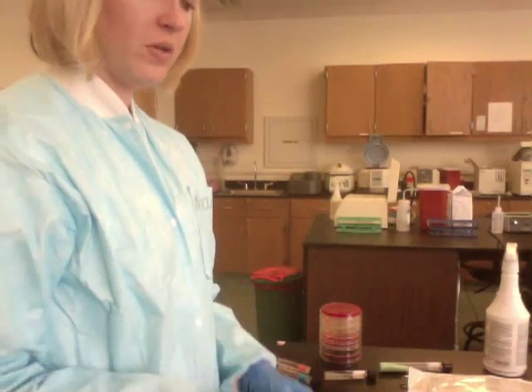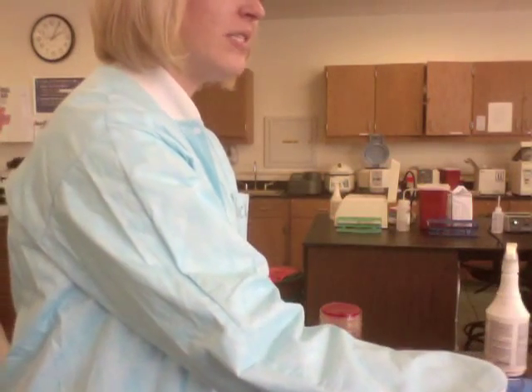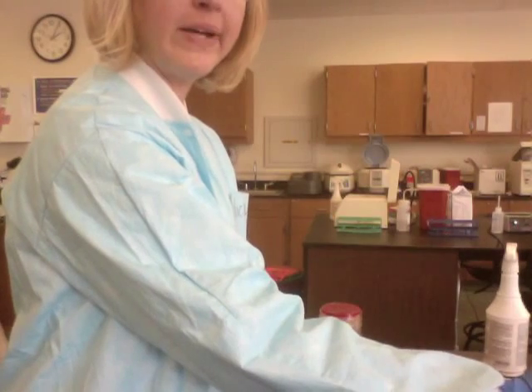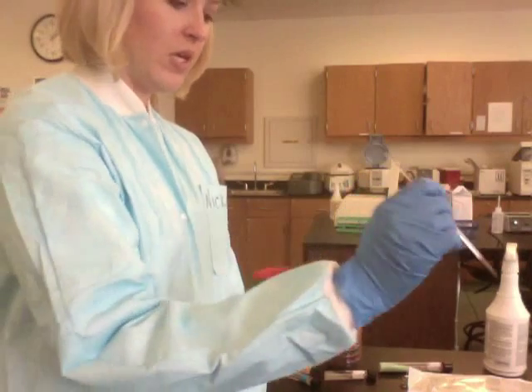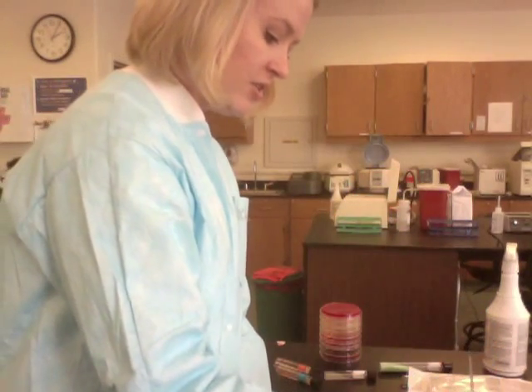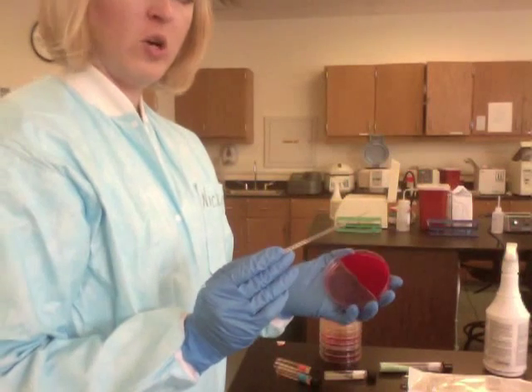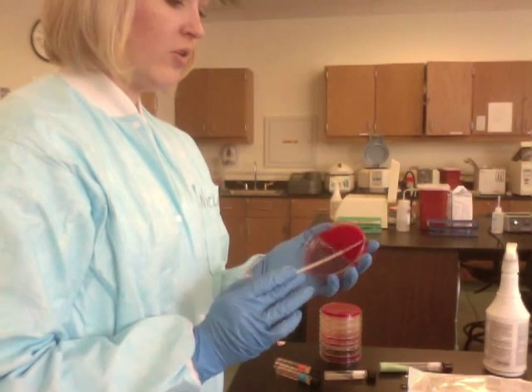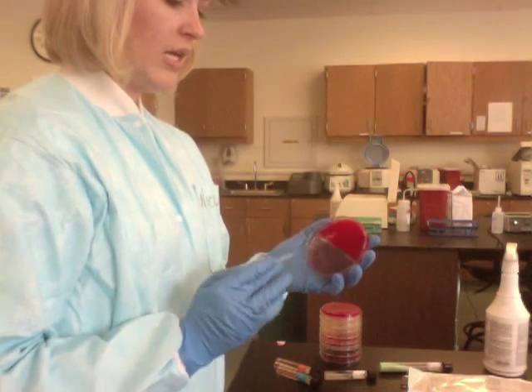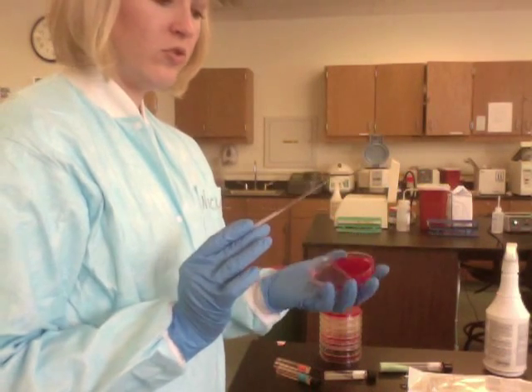We're going to have our urine sample and carefully open it under the hood with our gloves on. I'm going to take the smaller loop — the one microliter loop that is only used for urines — carefully out of the packaging, carefully dip it into the urine, and bring it back out. Then I'll open my urine plate and streak down and then across, hitting the sides. That is how you streak that side.